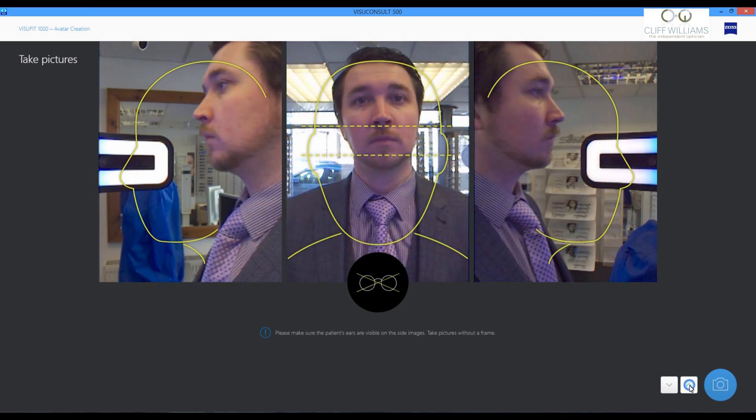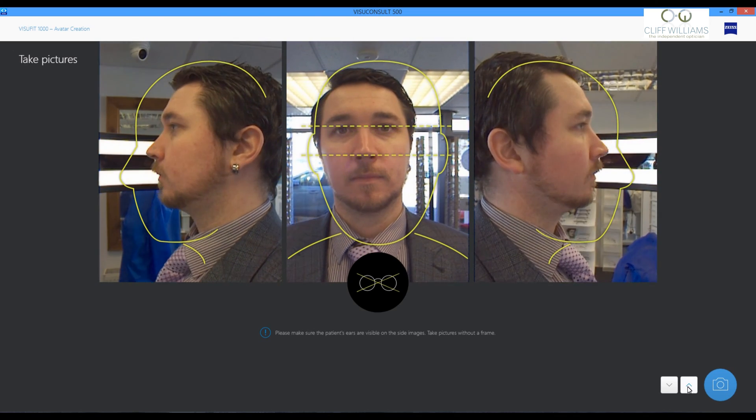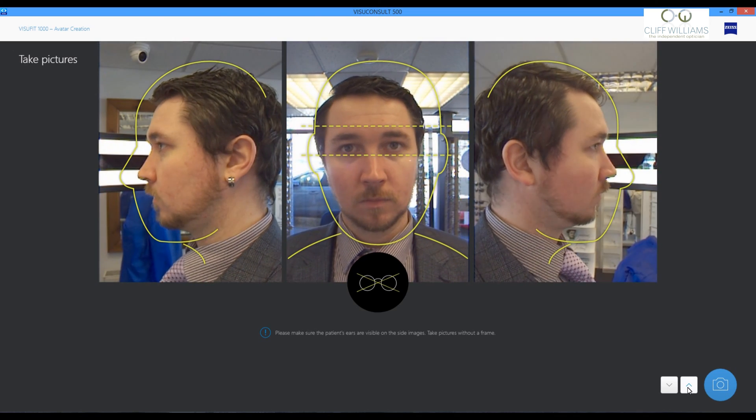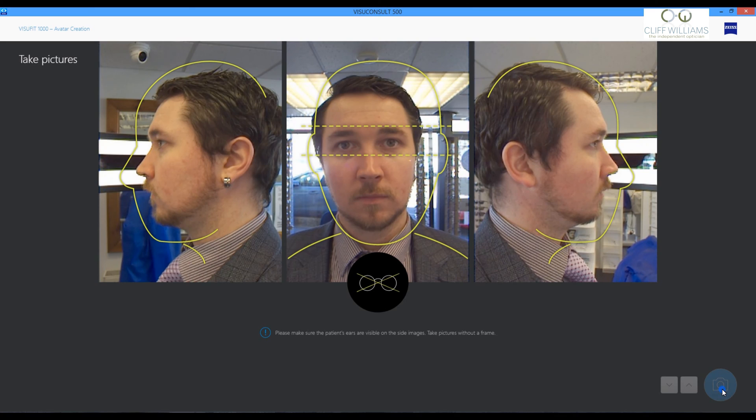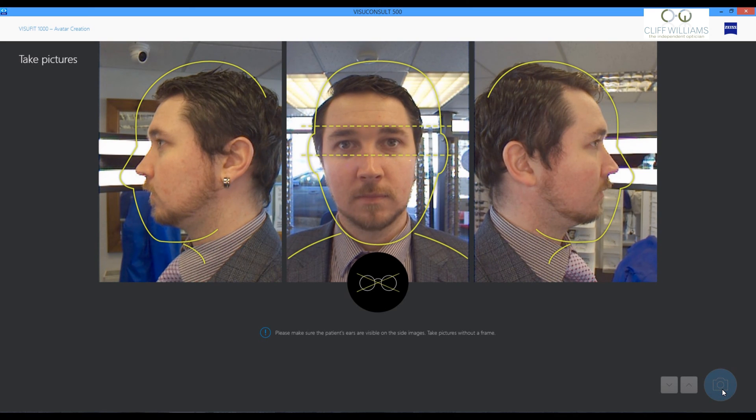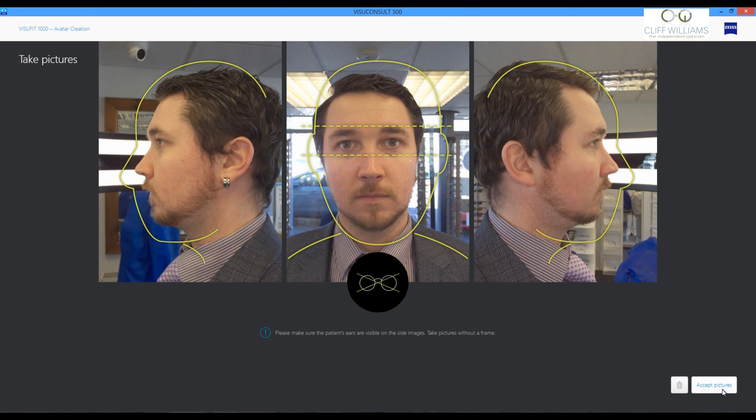So to make this easier, the latest upgrade allows us to take a picture without spectacles on. We can then put some key landmarks on this avatar.